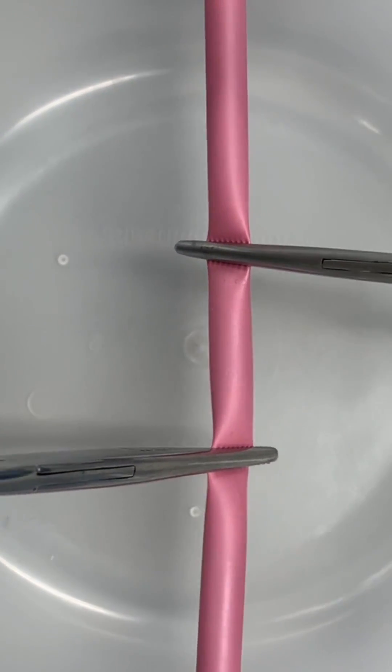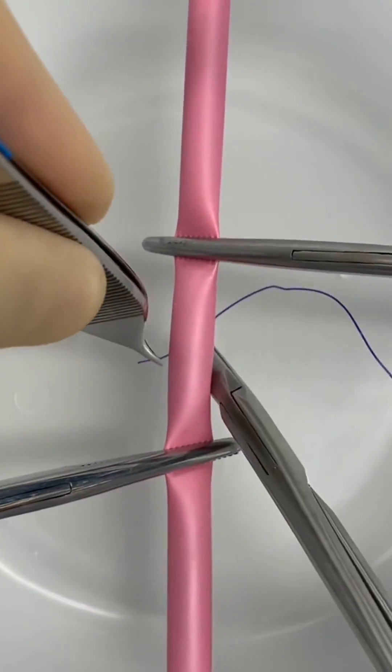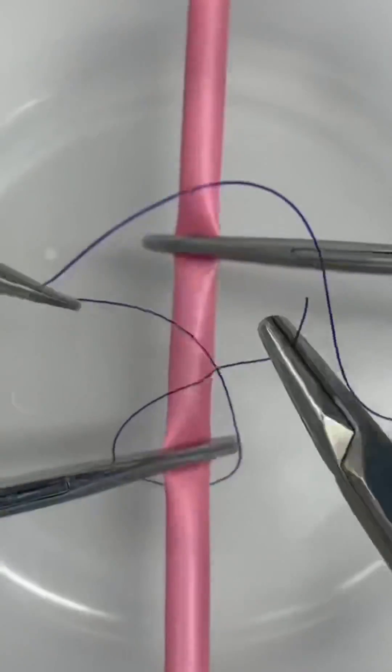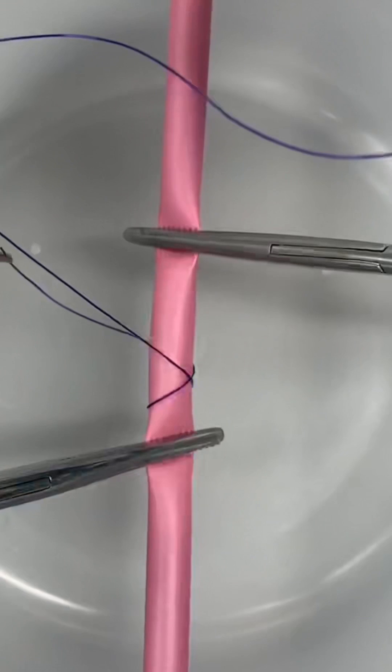Clamp the vessel using two hemostats and pass suture material around the vessel twice, ensuring that the short end goes over the long end to create an X.